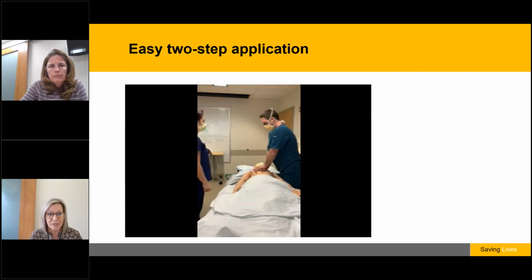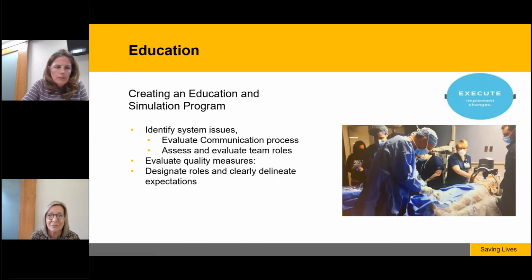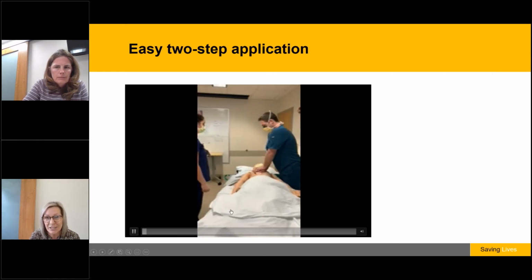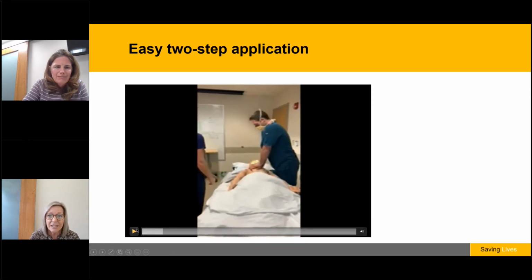So next we're going to show you this little two-step process that we have and how this came to be. Tammy, if you want to hold on just a second. I had a friend in EMS that sent me a video of the Alaska Fire Department and this process that they developed with placing the mechanical CPR device. In the way that they did it, they quickly lifted these patients, got the backboard underneath them, continued CPR, and then hooked up the device.